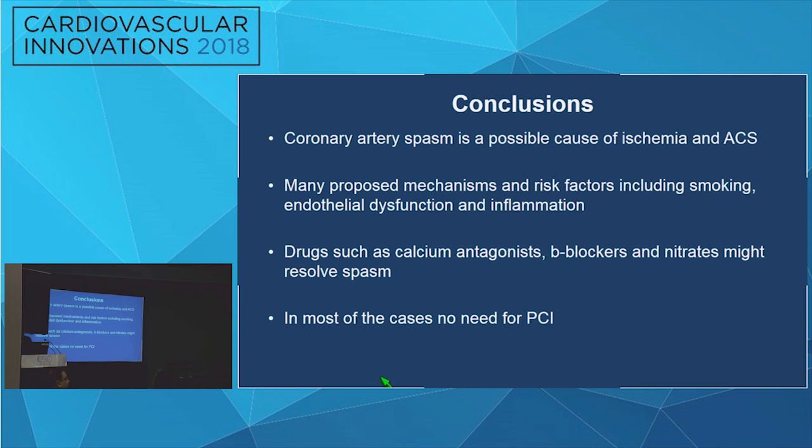I had an elective patient with chest pain. Did an initial picture. The LAD was completely shut down. ST elevations. I thought the patient was going into shock. She was. The LAD was gone. And I wired, but in my hospital, that counts as a failed intervention. I gave nitro after the wiring and everything resolved. So the case was reviewed because it's restricted, but excellent case.